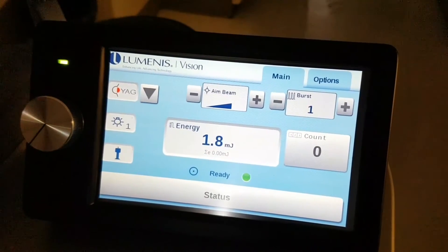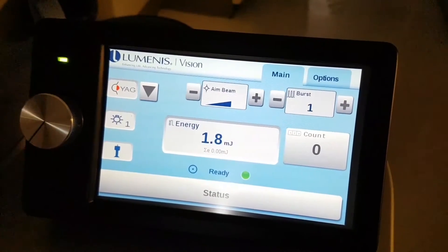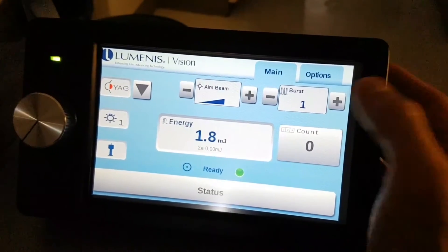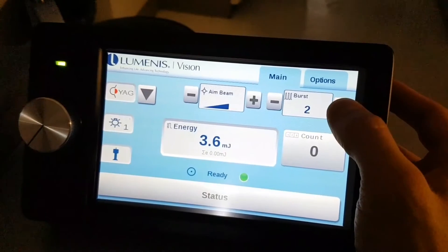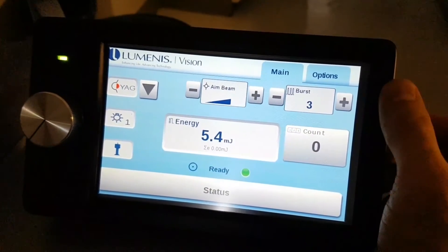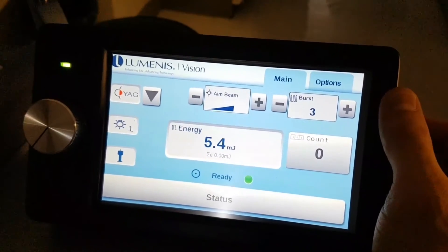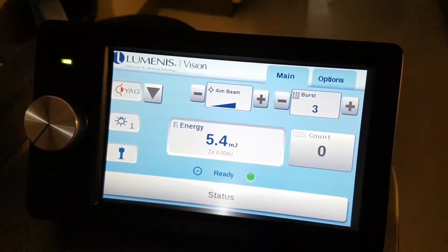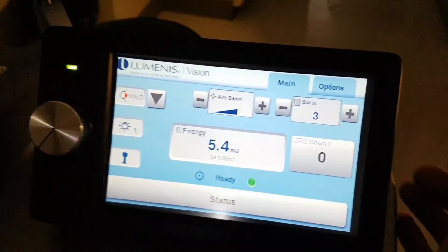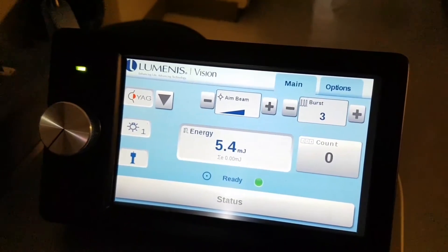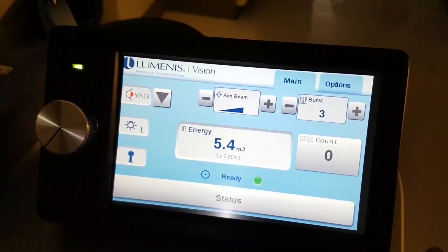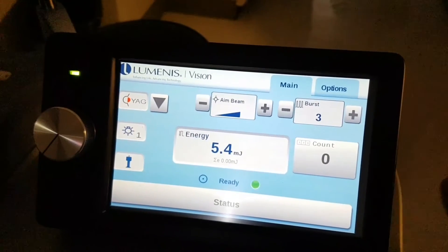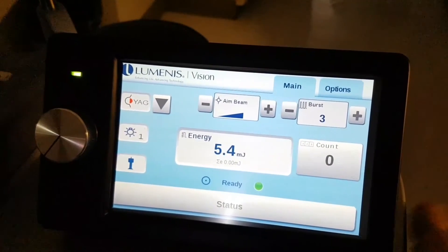If you are doing iridotomies, you can always use the burst mode. The burst mode has up to three bursts. These are very, very rapid fired bursts. You can't really tell the difference between a single burst and a triple burst.